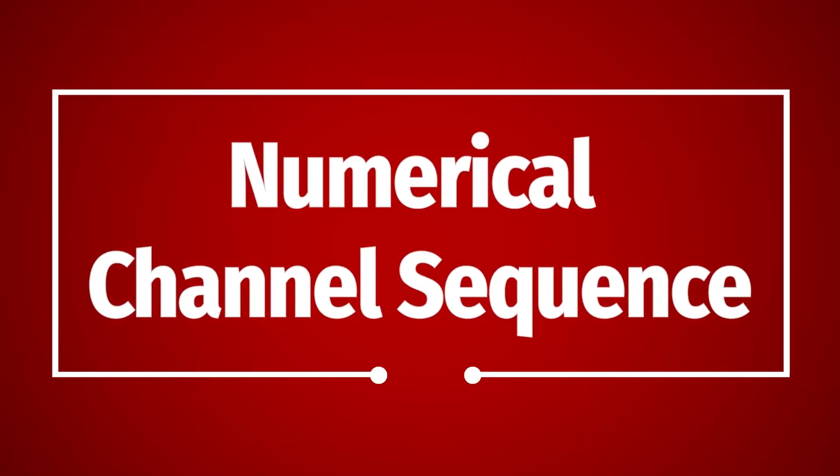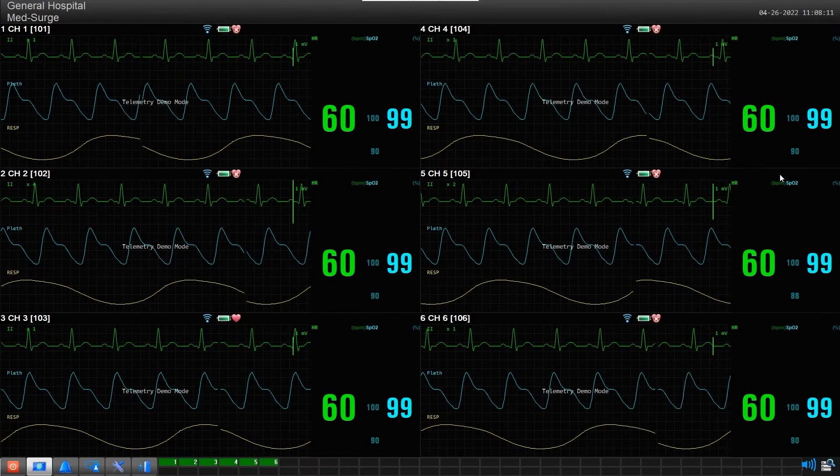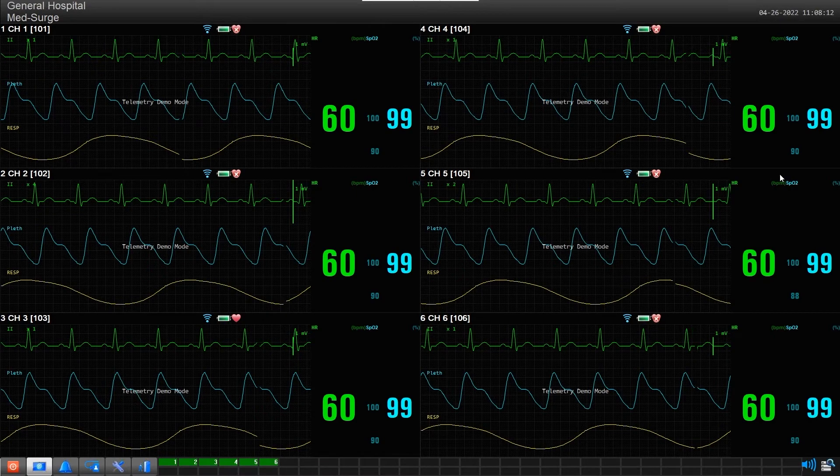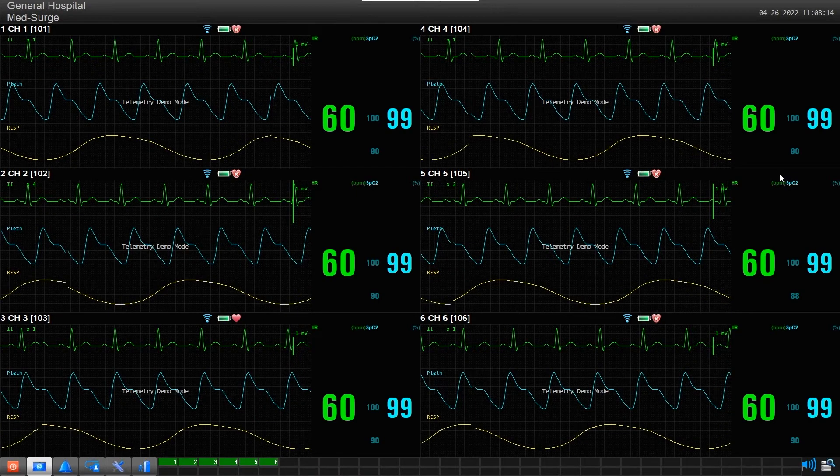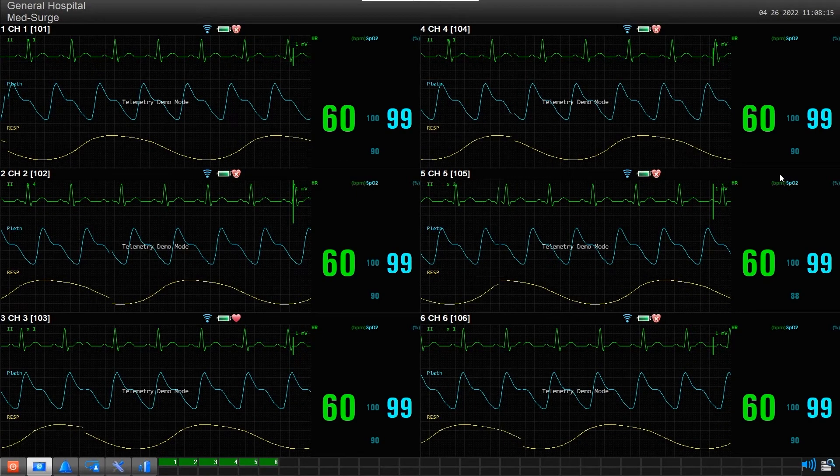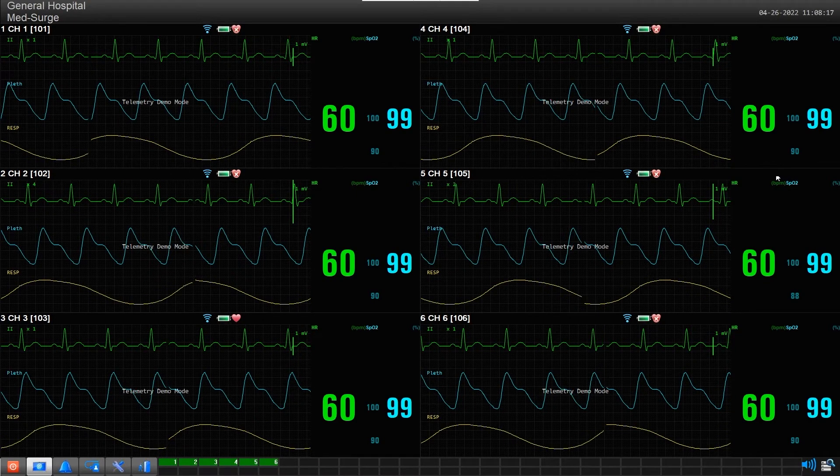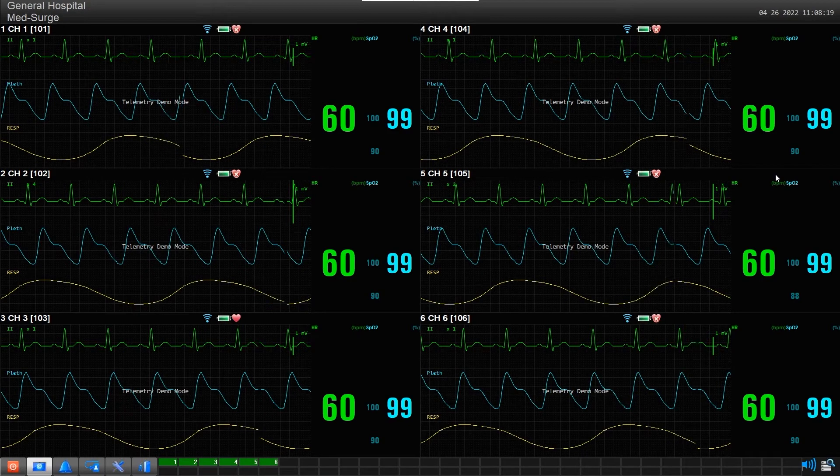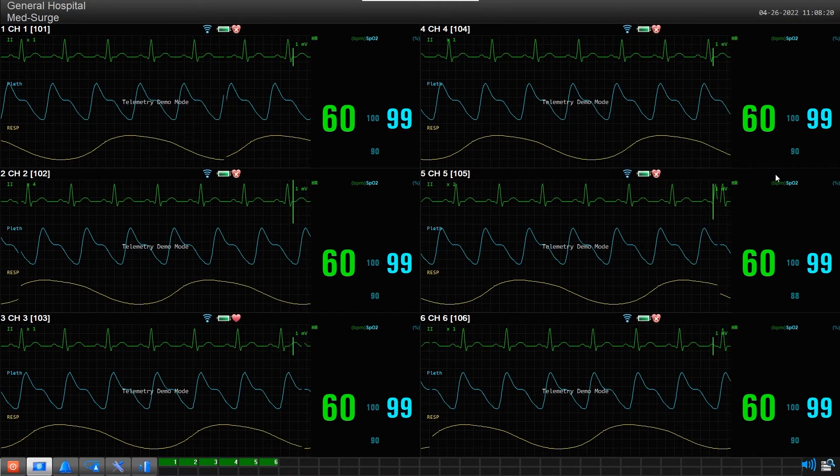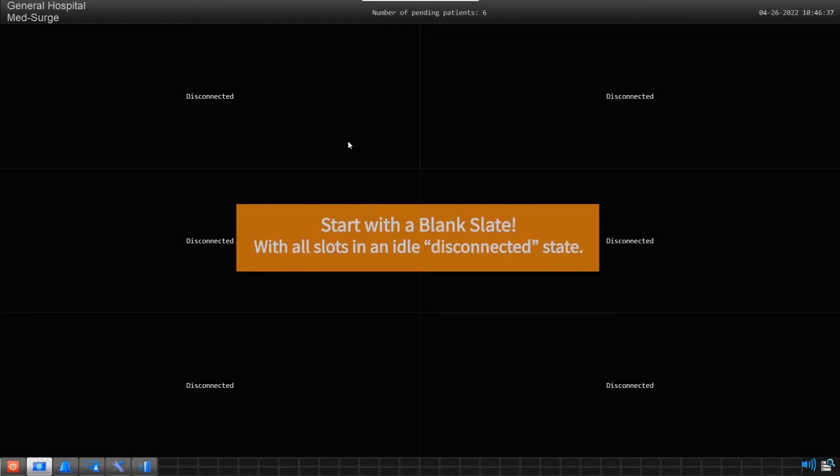Numerical Channel Sequence: You may want all your devices to remain in perfect numerical order and never change their positions on the screen. This can be easily accomplished by following a few simple guidelines. Step 1: Start with a blank slate with all slot positions set to Idle in a disconnected state.